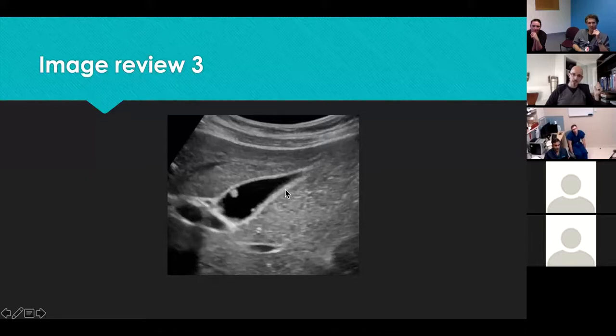So the same thing happens as I explained in the previous slide: because a lot of it falls into the beam width of the ultrasound with a lot of lateral resolution involved, it gets smeared, and that might falsely look thickened.